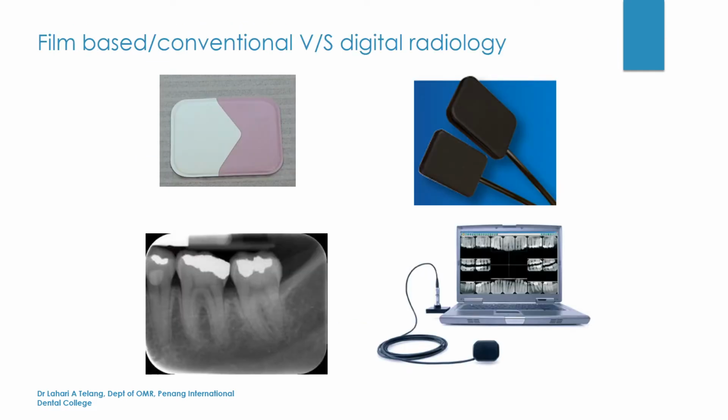So, when you're talking about film-based or conventional radiology versus digital radiology, the primary difference is the image receptor. What we mean by image receptor is the film that we use to capture the image, or a digital sensor which is used to capture the image. Essentially, the image looks very similar, whether it's film-based or digital radiology.